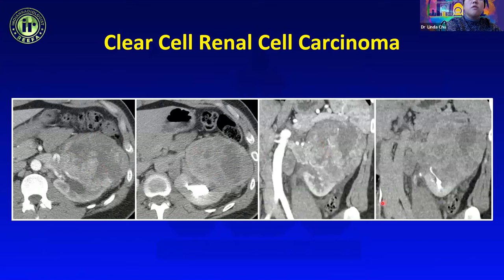Urothelial carcinoma can also appear as a polypoid filling defect within the renal pelvis. These lesions can be hard to see on non-contrast or arterial and venous phase images but are very well demonstrated on delayed phase images — which is why we include delayed phase in our four-phase renal protocol. One case shows a fairly obvious lesion; another is much more subtle, barely visible on non-contrast and venous phase, but clearly shown on delayed phase imaging and confirmed on retrograde urogram. The delayed phase is key for urothelial neoplasms.